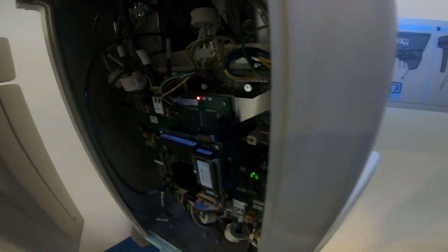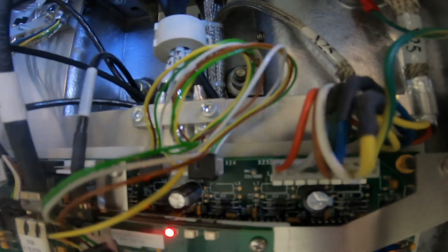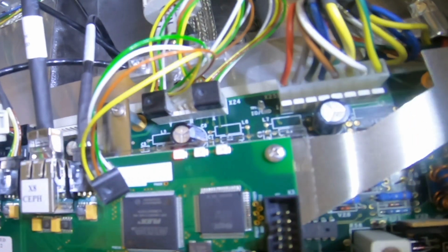What this means: there are 12 pins. The first 4 on the left are the Y motor. The next 4, the middle 4, are the R motor. And the last ones are the X motor.